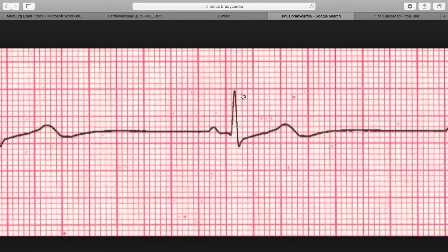So what is our QRS interval? Looking at the QRS complex, that looks like 2 boxes, and our QRS interval is 0.04 to 0.12, and it's 0.08. So that is normal.